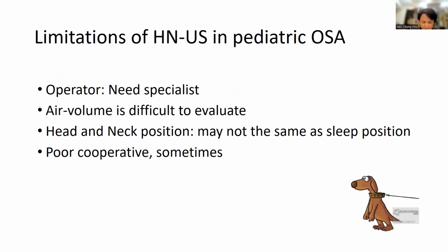There are still some limitations in the application of ultrasound on upper airway structure during sleep. The ultrasound is very much operator dependent and needs some training. The airway volume inside the lumen is very difficult to delicately evaluate. Also, the head-neck position might not be exactly the same as in the sleep status. And sometimes some of the children will not be able to fully cooperate during the examinations. However, this is a non-invasive tool which could provide a new technique in further sleep research.